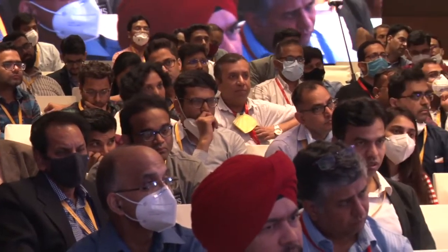So use dilute contrast and be extremely slow in deflating it. Give it enough time, and you might end up pulling the entire system if it just doesn't go back into the guide. They become extremely bulky after 50 bar. Yes, I use OPN. I don't dare.